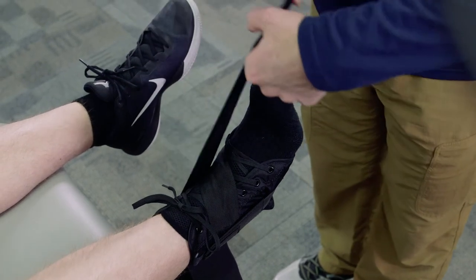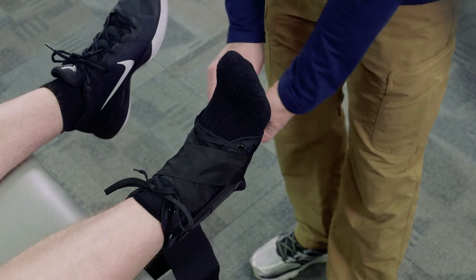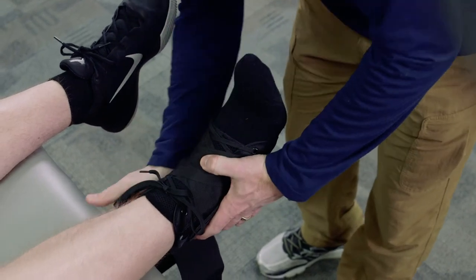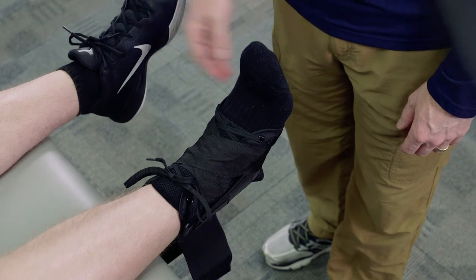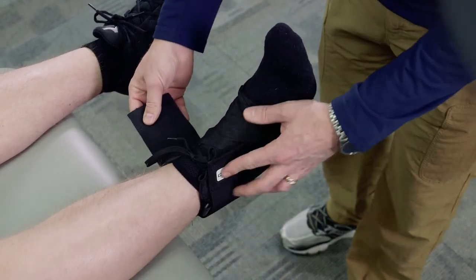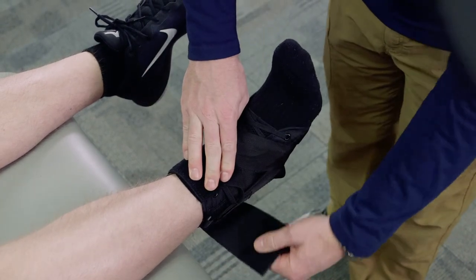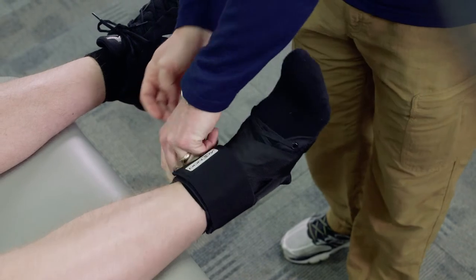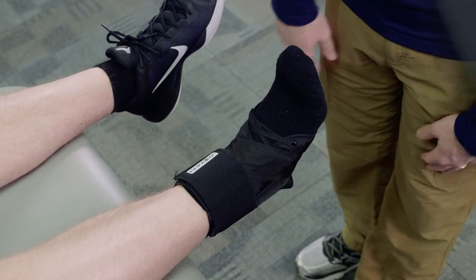We take the opposite strap and go around in the exact opposite direction underneath the foot. This one stabilizes without necessarily pulling the foot in any one particular direction. The strap is really just to help hold the lace down so it doesn't come untied while they're participating, and gets secured to make sure these straps don't come off either.